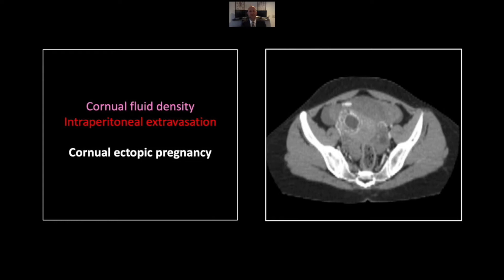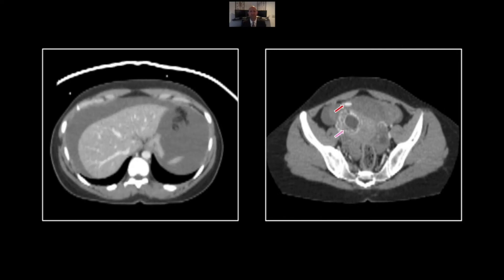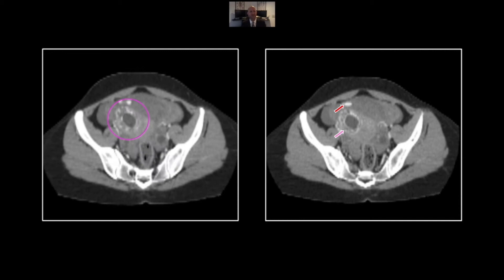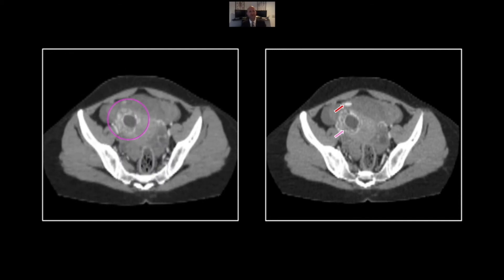Our next case is a cornual ectopic — a very important finding to make. Ectopics in general are dangerous, but those in the cornua have a real tendency to cause acute hemorrhage and poor outcomes. Here you can see the gestational sac in the right uterine cornua. Note the lack of a myometrial rim around the entirety of that gestational sac, which allows the diagnosis of a cornual ectopic. There is intraperitoneal extravasation — a focus of actual contrast extravasation — with extensive heterogeneous and hyperdense fluid throughout the peritoneum. Again, note the lack of a myometrial rim surrounding the gestational sac.